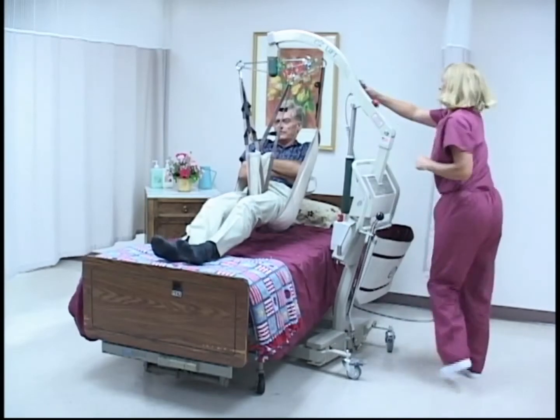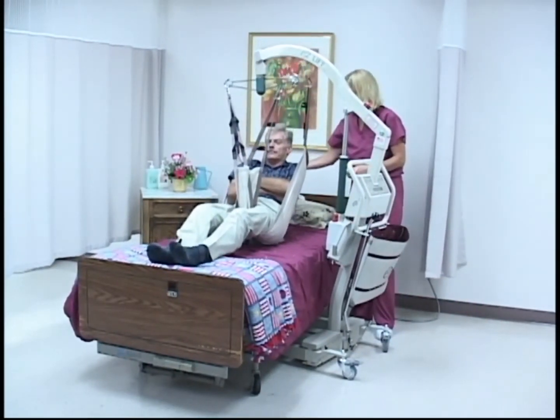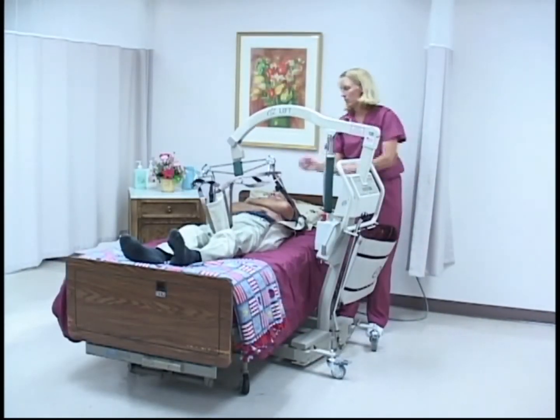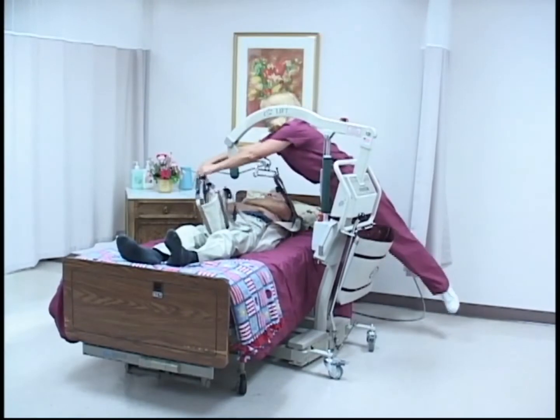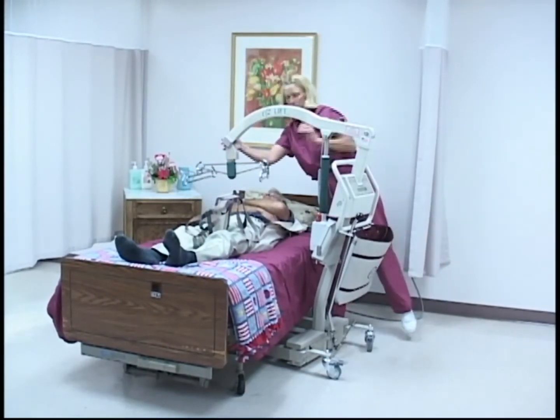Lower the patient. It's recommended to support the patient's head during this step. When the patient is fully lowered, remove the sling straps from the sling hangers. Using the log roll method, remove the sling.